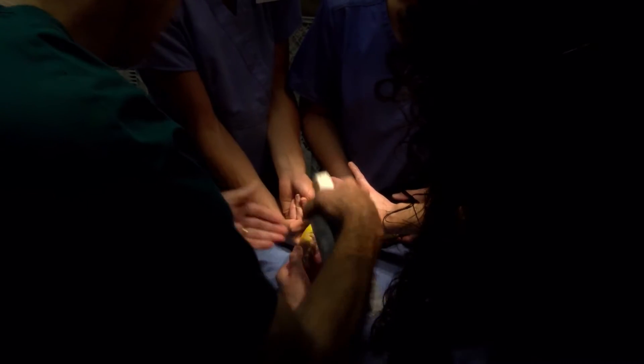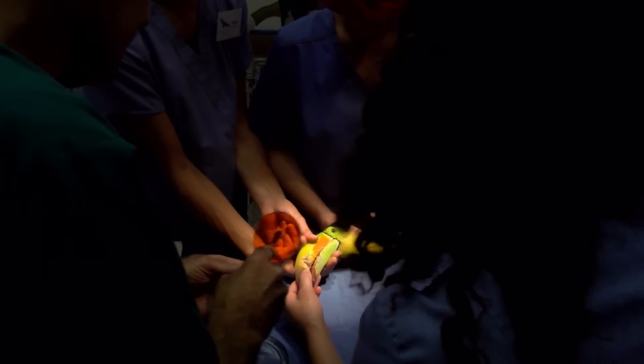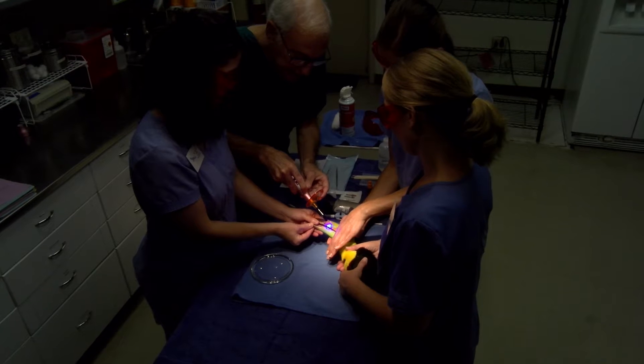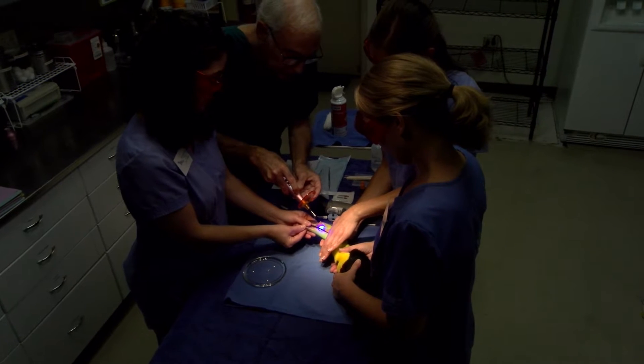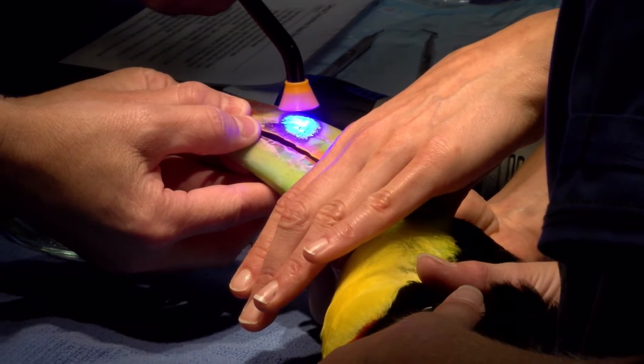I'll pull him down some. I have to change his towel again. Let me put my glasses on — now I'm going to look through the shield. We only have to go ten seconds with this. A dental ultraviolet light is used to quickly activate and harden the bonding agent without generating heat.